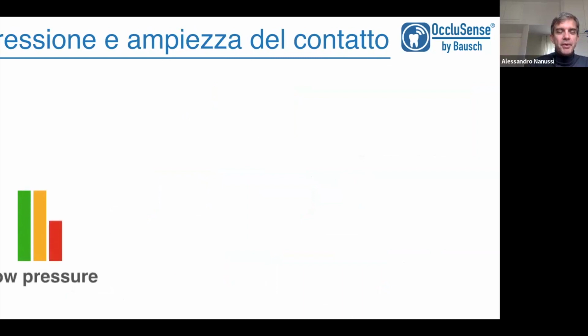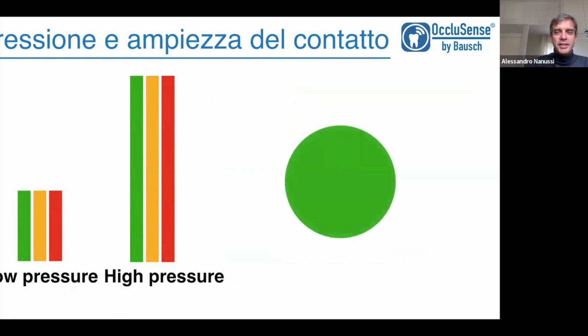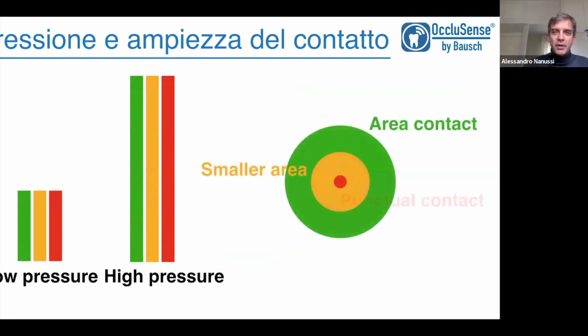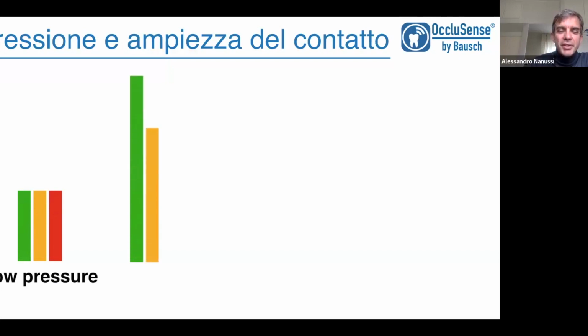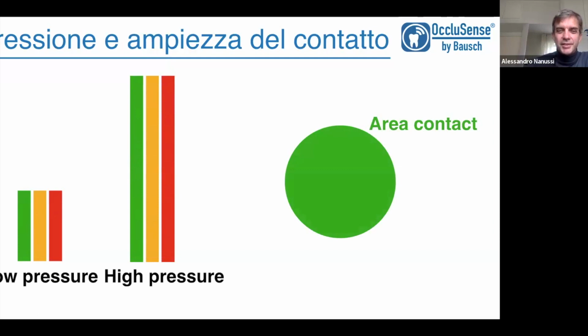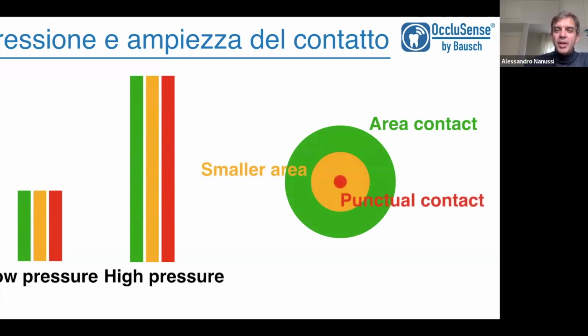And remember this simple signal that shows us the different colors on the report. Because in our grinding patients, people who overload the teeth, the restorations, the prosthodontic treatment, we usually see green area contacts and not only punctual contact. If you see punctual contact, you have a point of contact on your teeth and you will have so much force on this single point of contact. So I prefer to find areas, which are easy to manage, and ensure that my forces will be distributed over a big area, so I don't risk a failure of my work and a crack.